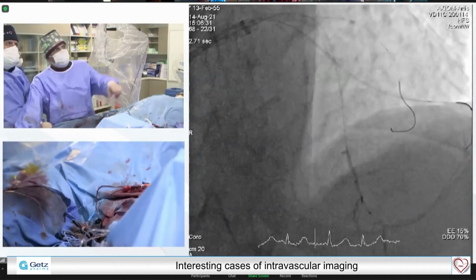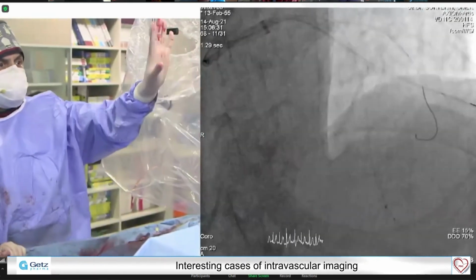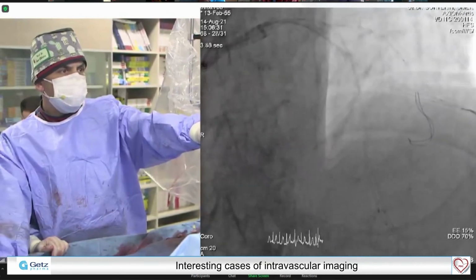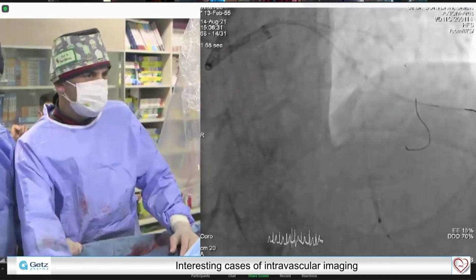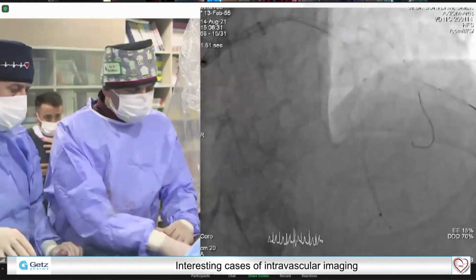I think I can. You see, I have to use this exactly, and I know now where I should stand. It's not that distal. Maybe I could do some ballooning if I need it. Obviously, I will not stand there.